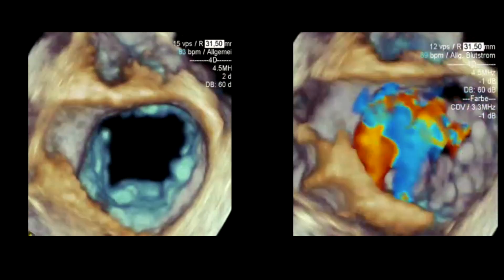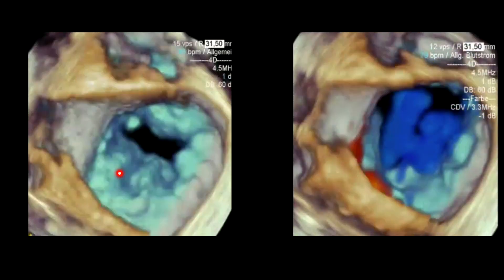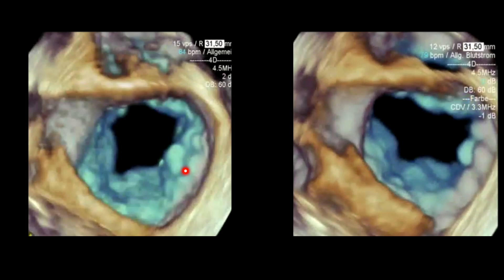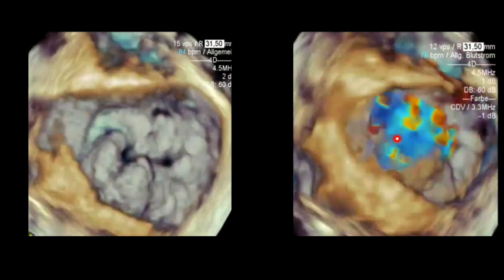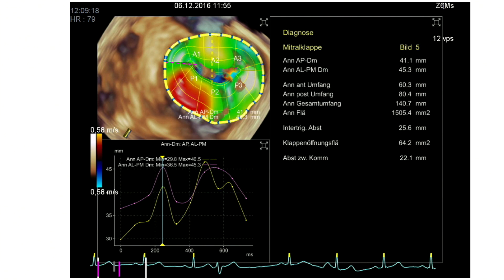Here is an example of a patient who has mitral valve prolapse with two scallops involved — this is P1, this is P2, and probably the remaining part of the posterior leaflet is also involved. We can nicely see the origin of the jet exactly from these two prolapsing scallops. With special reconstruction techniques, where we track not only the annulus but also the anterior and posterior leaflet, we are able to reconstruct the valve and perform measurements such as the anterior-posterior diameter or the circumference, and also color-code the valve to see which portion is actually out of plane.